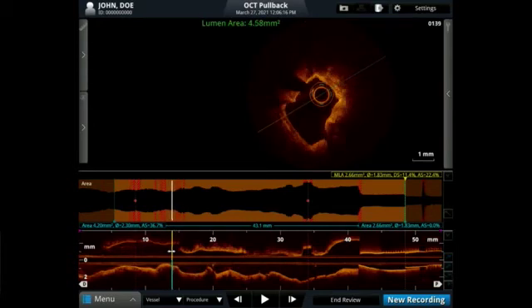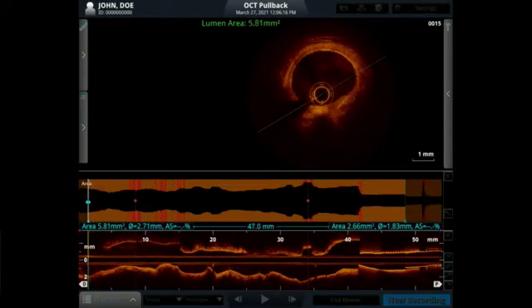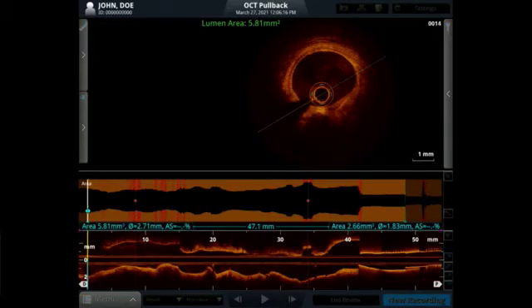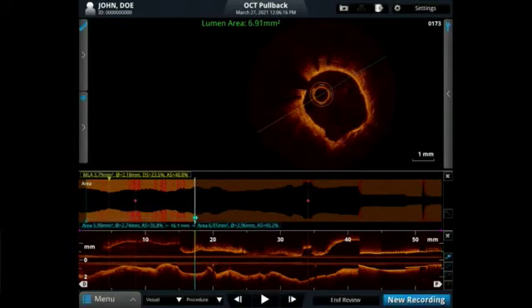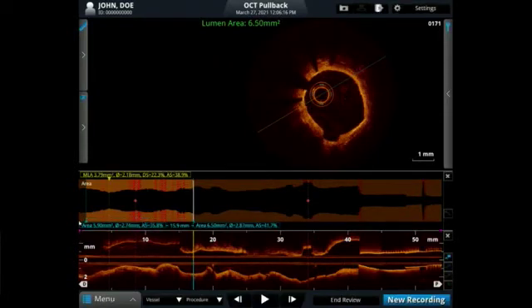Just take the blue proximal marker. Let me get this for you. Here we go. So I think I can probably land somewhere here. Does everyone agree? Yeah, yes, sir. Maybe a bit distal. You're fine, right there. Do it whatever you think. Nice, perfect. I'm going to bring this in. Perfect. That's enough. I'll probably land somewhere here. Yes, that's a good spot.